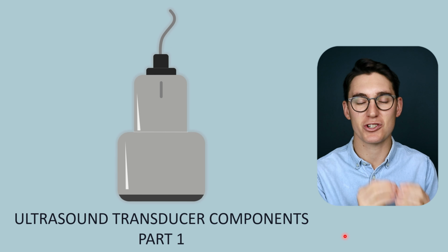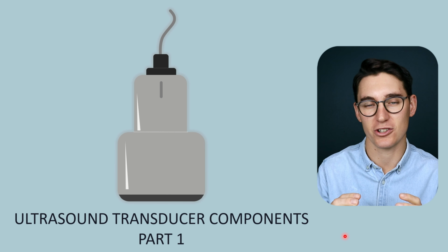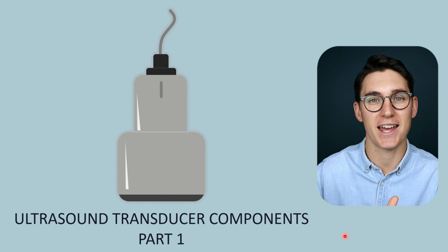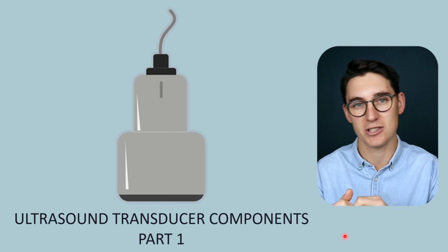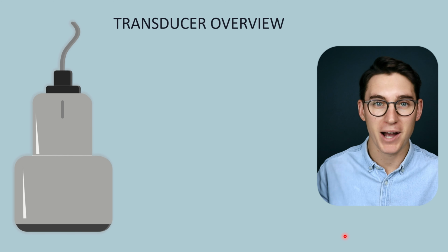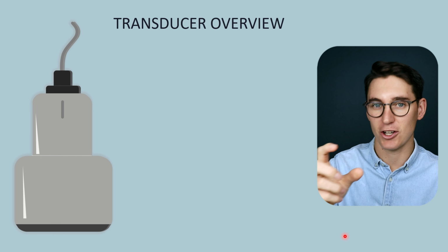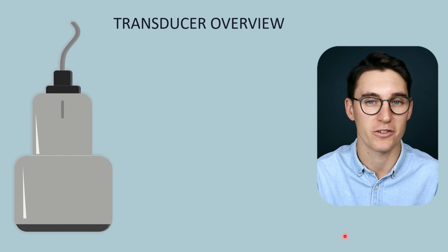Now we're going to look at the ultrasound transducer itself and how the various different components of that transducer go about creating a sound wave, as well as receiving echoes back and converting the energy from those echoes into a digital signal that we can display on our monitors. So if we look at the transducer itself, it has a power supply coming to the transducer and a plastic or metal housing that the operator can hold. It also protects the operator from the internal components of the machine.